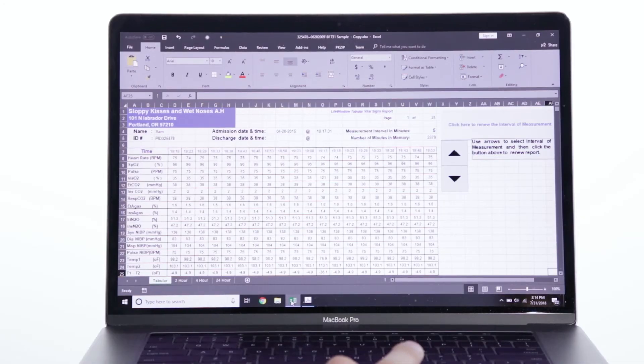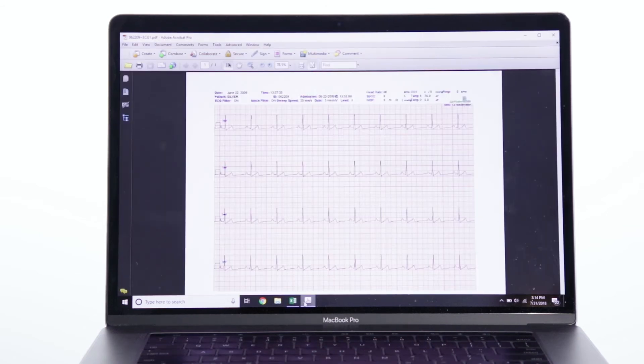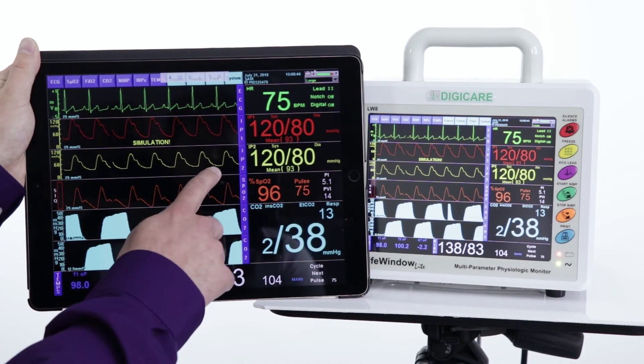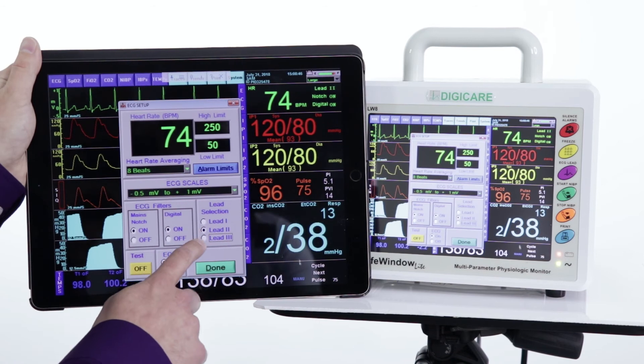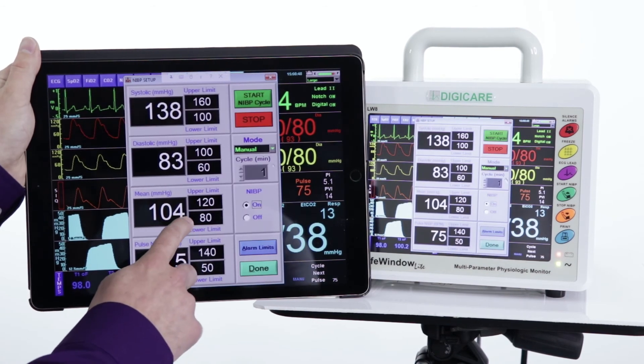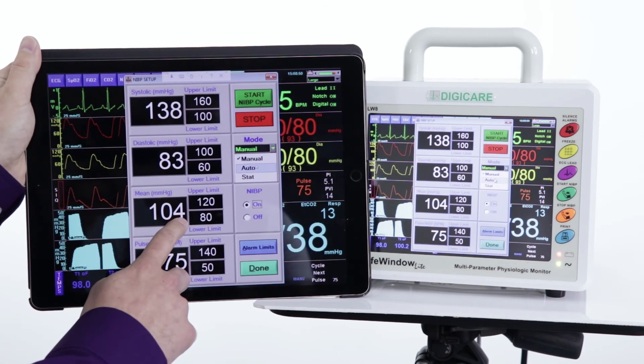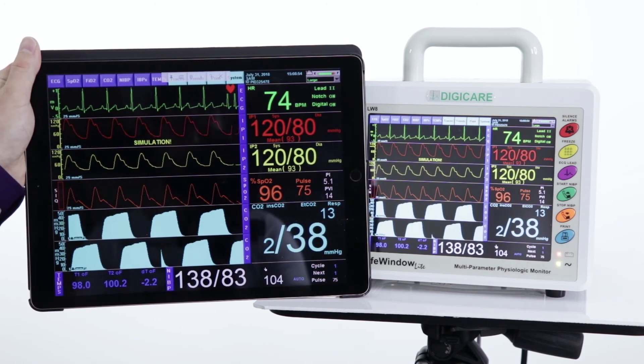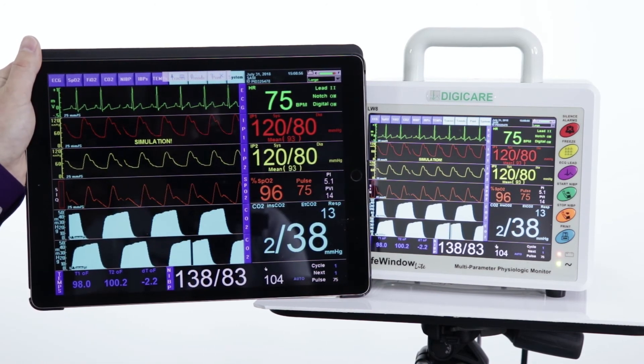Patient data can be saved in Excel and PDF formats, so that it can easily be printed or transferred to any practice management software. The Life Window Lite can be viewed or controlled through remote access software from your computer or smart device. In addition, we have included the ability to connect with the SmartFlow anesthetic sheet, giving users access to real-time anesthetic records.